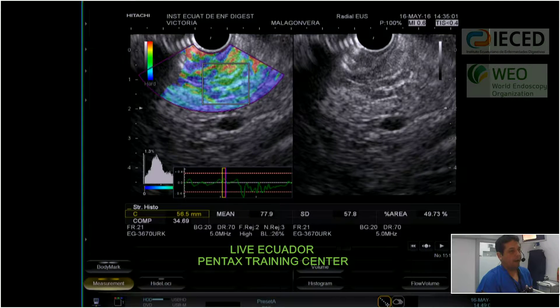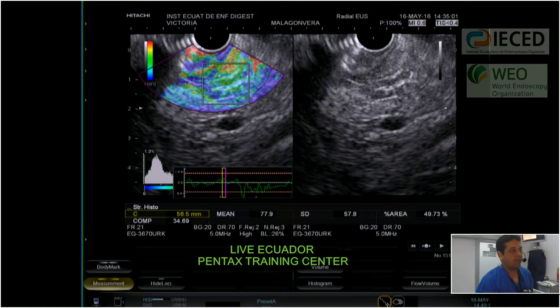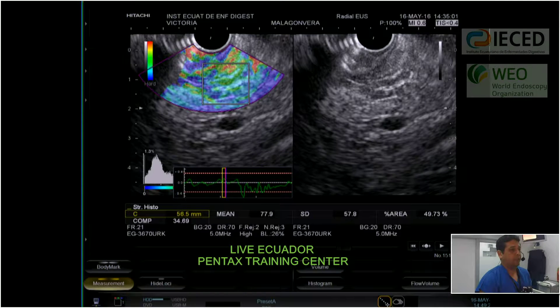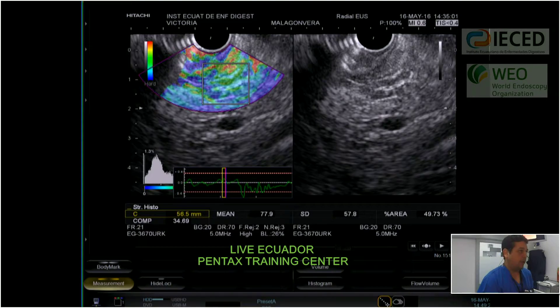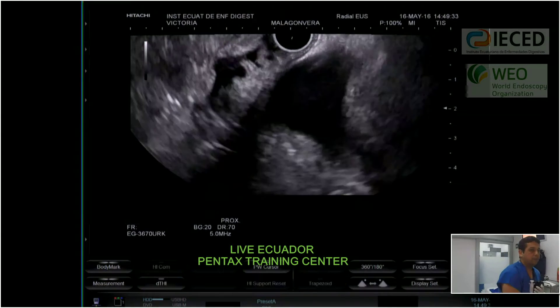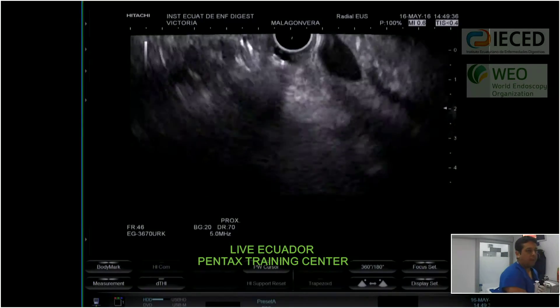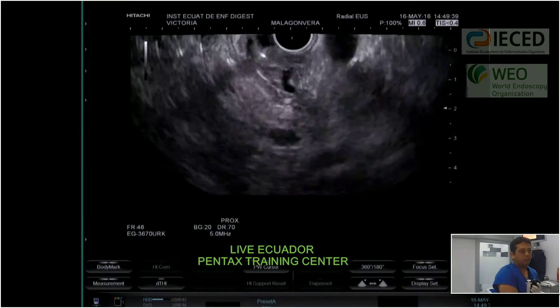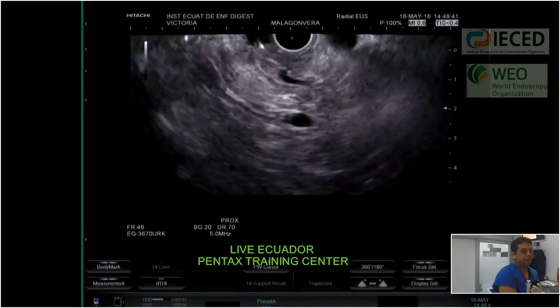A mean value between 50 and 100 can reflect chronic inflammation with fibrotic areas. In this case, we can say as a result of this examination that this patient has fibrotic areas observed in the head of the pancreas, and less in the body. With the symptoms and the altered laboratory values, we can confirm the suspicion of chronic pancreatitis. We will now evaluate the biliary tract.